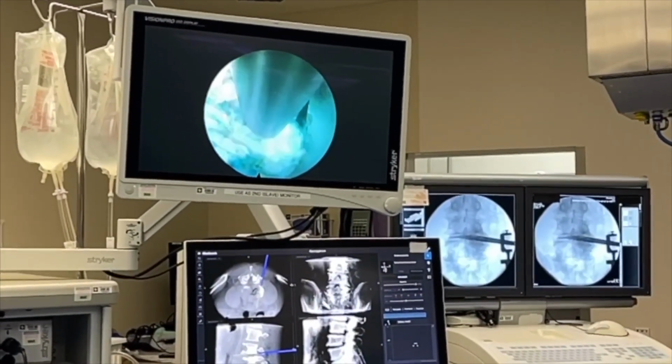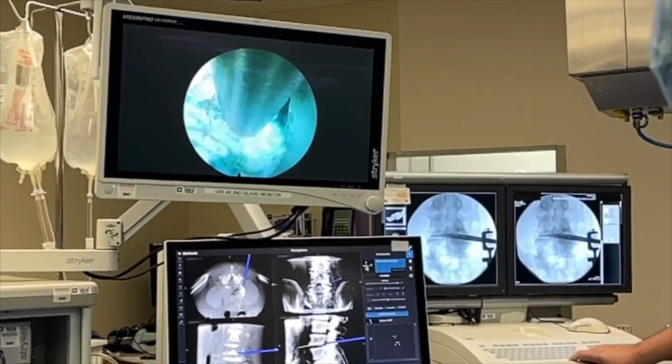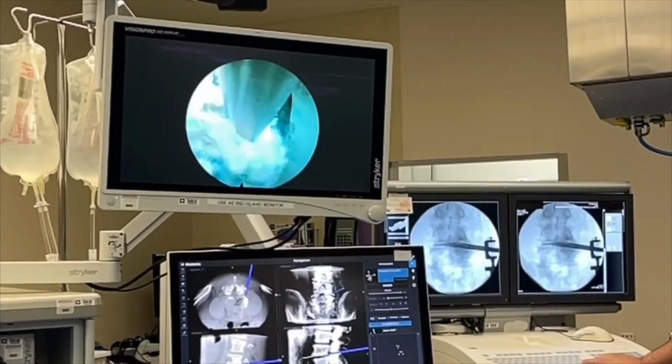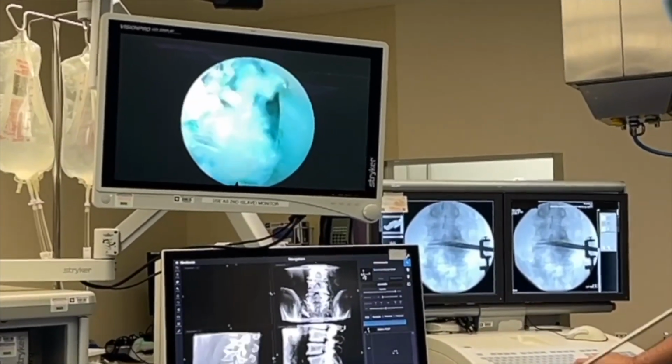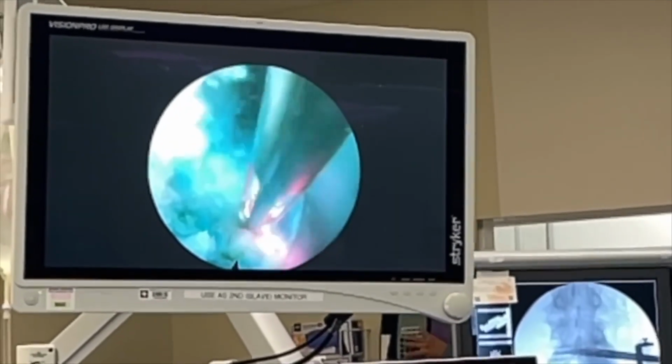Got the scope almost straight up and down now, and I'm going laterally, and this is the middle of the corridor, but look how lateral I am on the navigation, the left upper hand image. That tells me how far lateral I am, plus a little bit. So I just have to get this toward me. Alrighty, I'm working toward me laterally now.